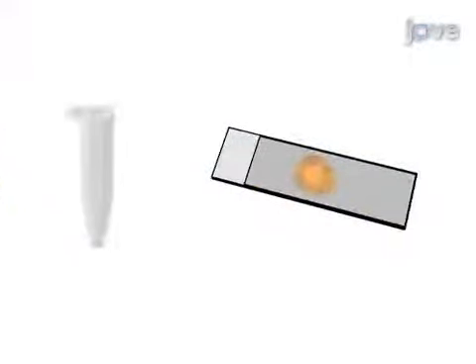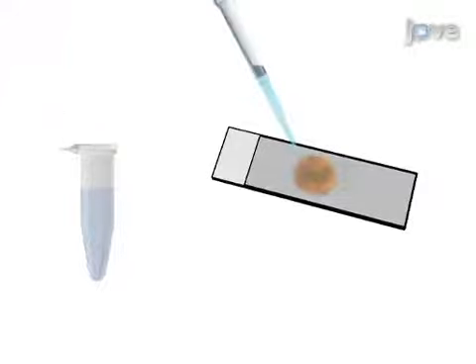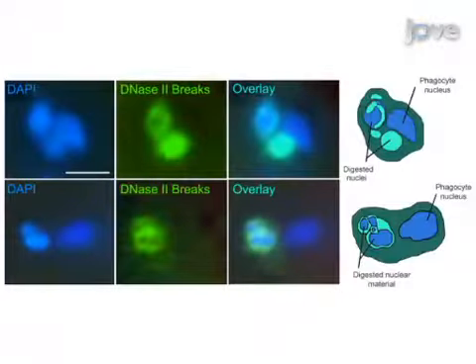Next, the labeling reaction is performed using the enzyme Vaccinia topoisomerase and ligatable fluorescent probes. The final step is tyramide-based fluorescence signal enhancement. Ultimately, fluorescence microscopy is used to assess phagocytic clearance of dead cells in tissue sections of focal brain ischemia.